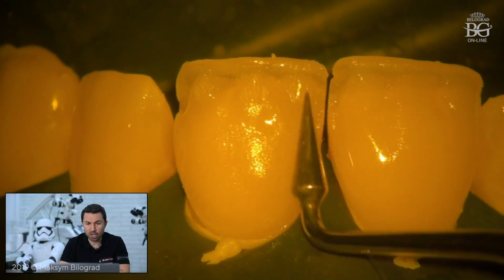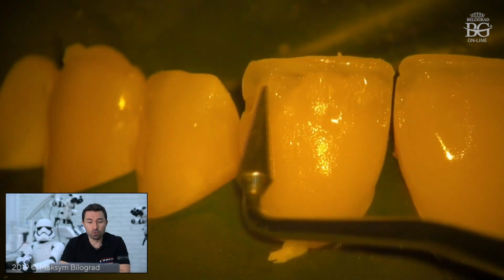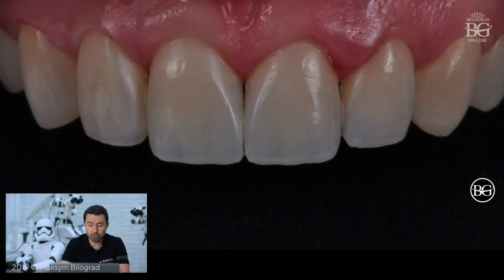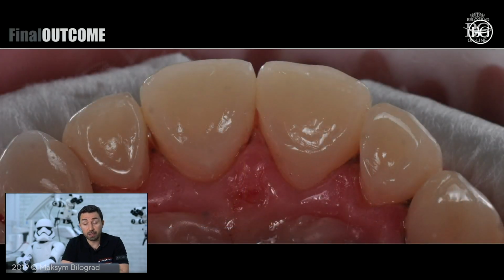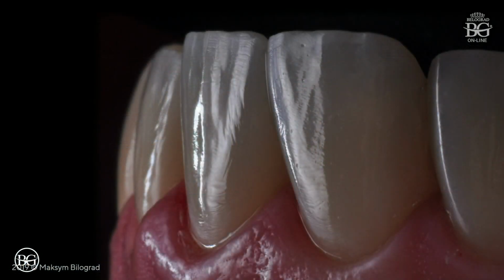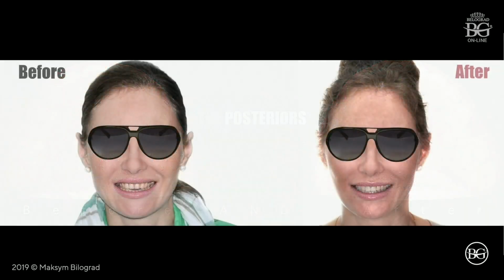At this moment in 2013, actually I didn't know that we can do it in an easy way, and that's why I decided to do freehand. But anyways, we got that result, we restored teeth and we made some finishing and polishing procedures. We created texture. You can see how these palatal sides look like after copy-paste technique, which is really nice. Before and after, upper and lower teeth, frontal zones with texture and relief, upper jaw, the new smile.